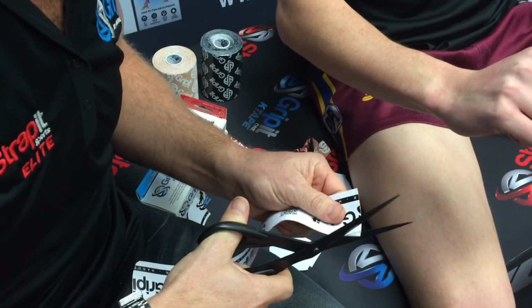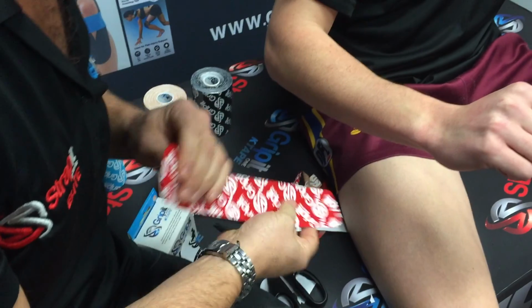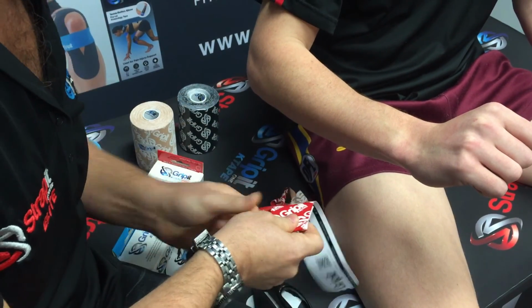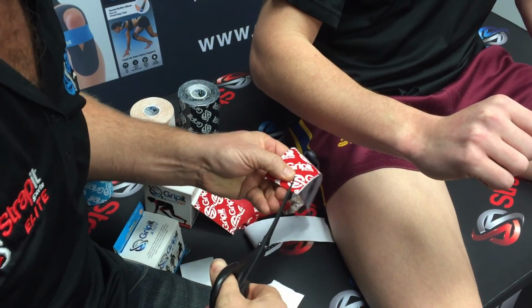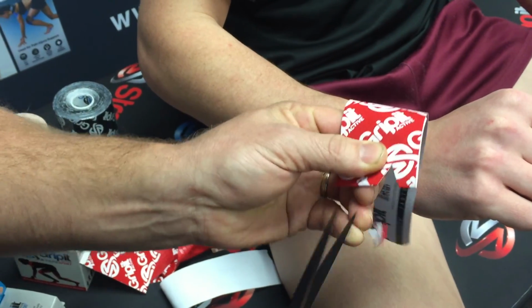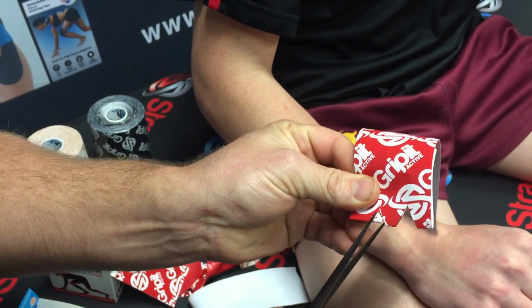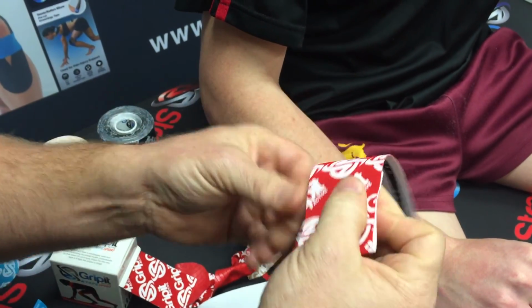Okay, so first round off our edges, which is really important so it doesn't get scuffed against your clothes, or if your fingernail or something hits the edge, it can come off more easily. So what I'm going to do, watch me here guys, just getting close here. These little diamonds you make are where the fingers are going to slip through so that we can create a really good lock of our tape.